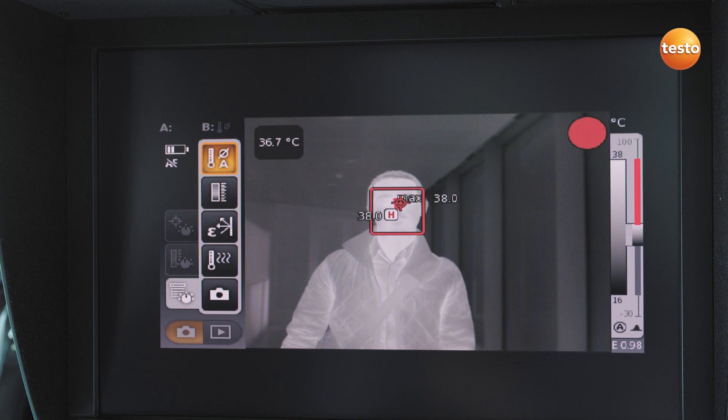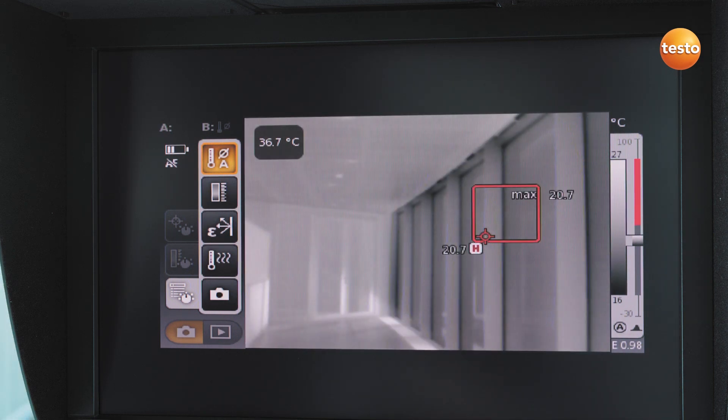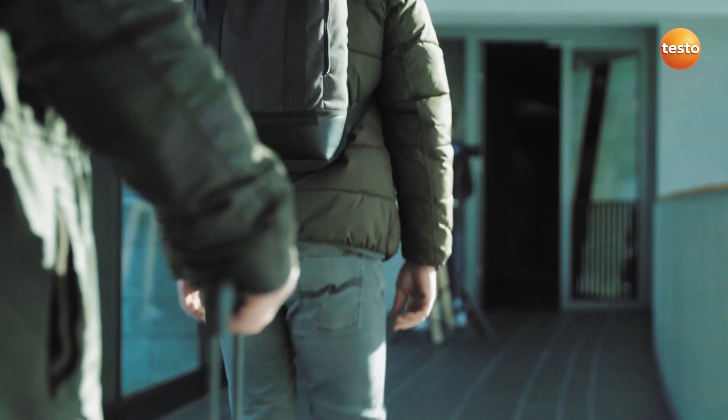In the case of a red signal, the person must be separated for a closer examination by medical personnel. Further checks can now be carried out.